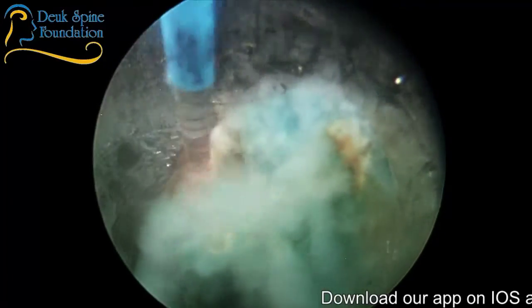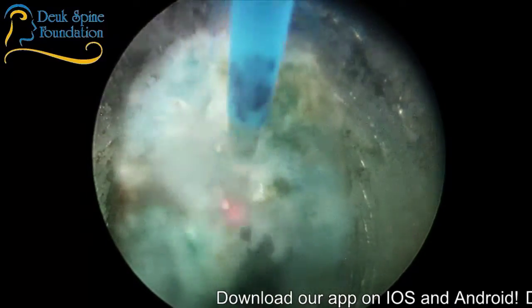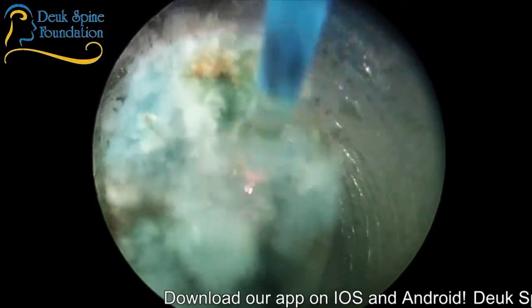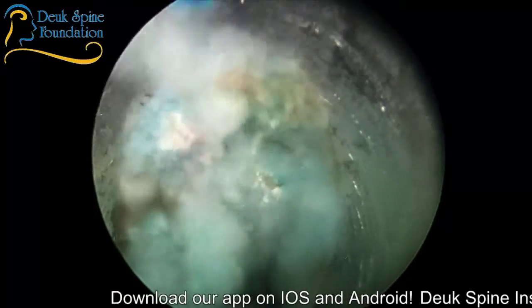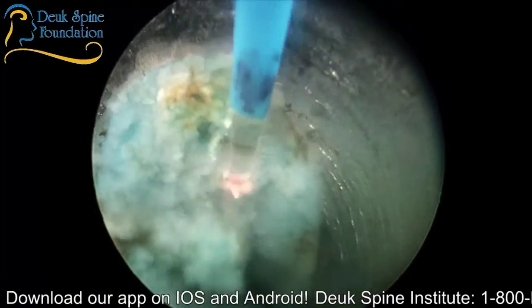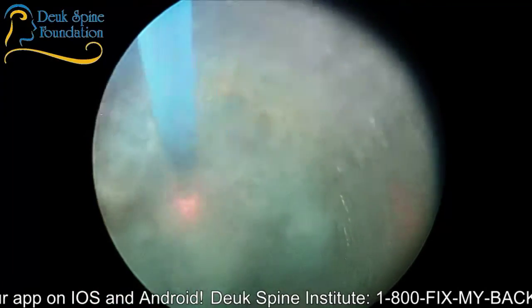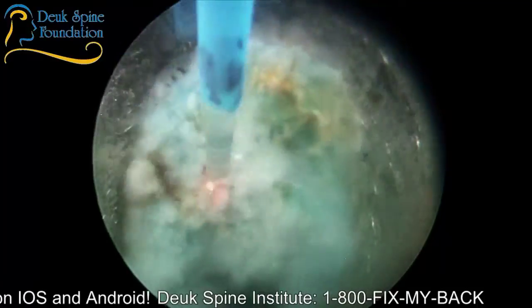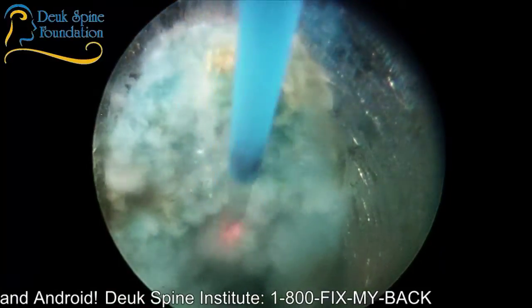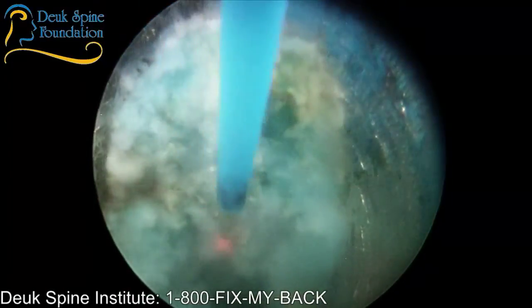And by the way, the problem with fusing, and you may already know this, in a patient who already has instrumentation in, is a lot of times you have to remove that old instrumentation to be able to do the new fusion. And so removing the old instrumentation would mean taking out all the screws and rods from C4 to L3, which would be a really big undertaking.